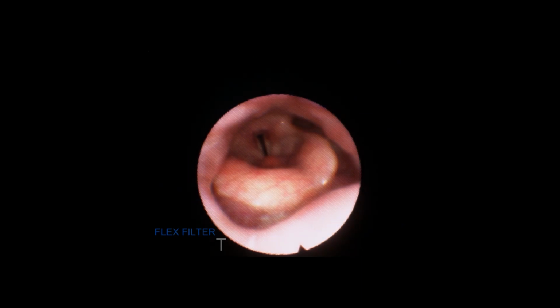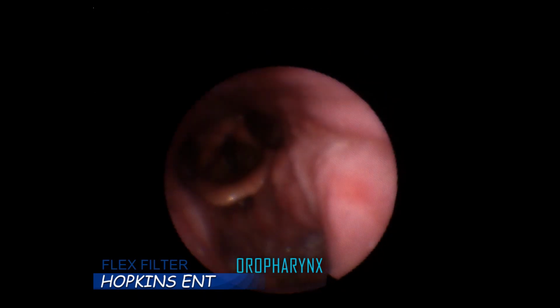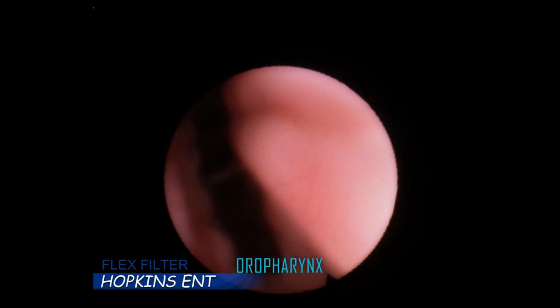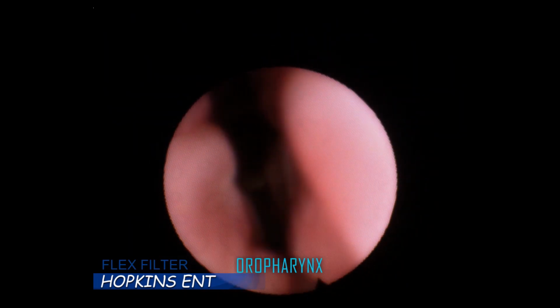The first one is an anteroposterior collapse. As you can see, the lateral collapse is very minimal compared to the gross anteroposterior collapse that you are having here. Then for the second video, you have a typical lateral wall collapse. You can see here there is practically no anteroposterior collapse. The collapse is mainly happening in the lateral pharyngeal wall, in the lateral dimension. So this is a classic lateral complete collapse at the level of the oropharynx.